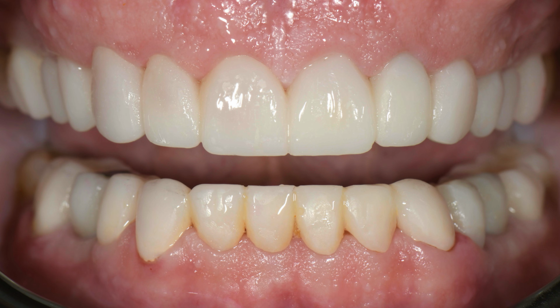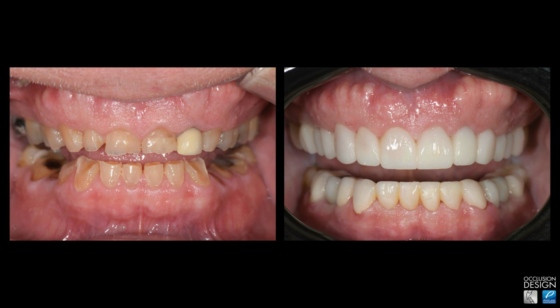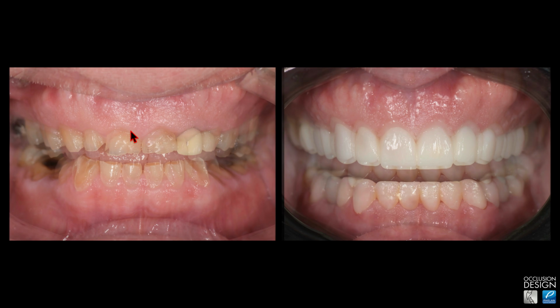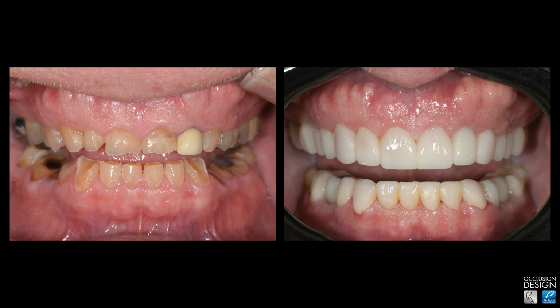And so here it is as we're testing it. Before and after, with provisionals. These are just provisionals. If you look at my last Dental Excellence video, I showed you how to get the shiny provisional finish like this. He actually dislodged the lower anterior. That's why it looks funny. I had to reseat it. But the upper's been seated and didn't dislodge. You can see how great the tissue looks. Here, the tissue looks a little off because I reseated it right then.